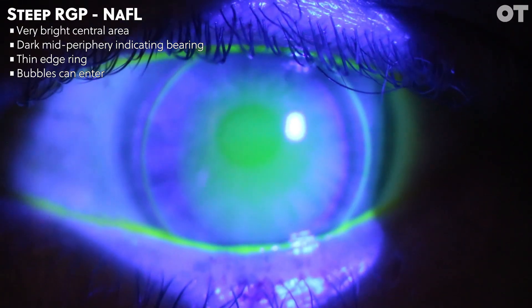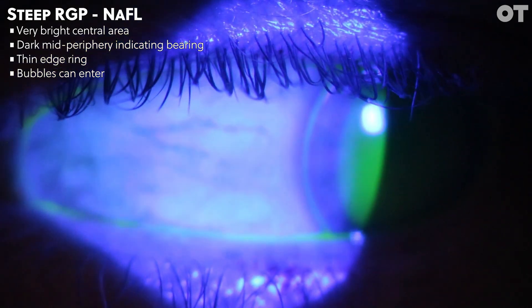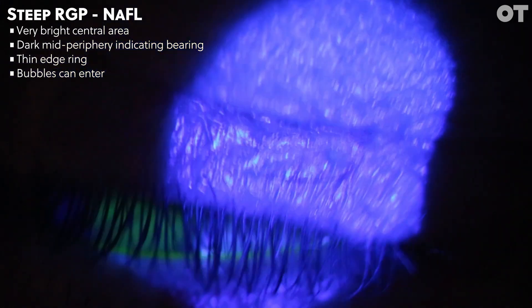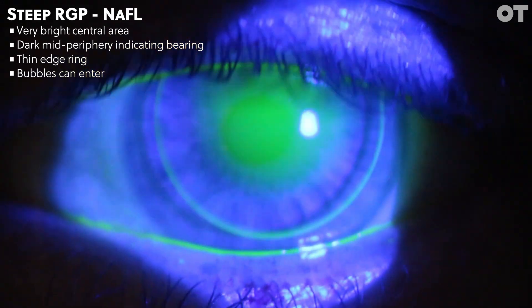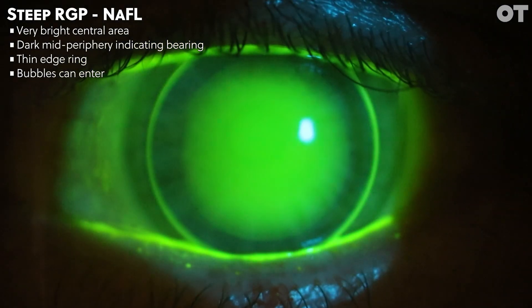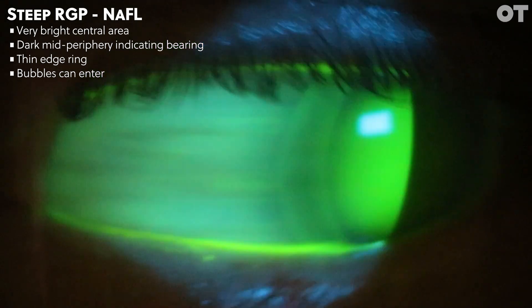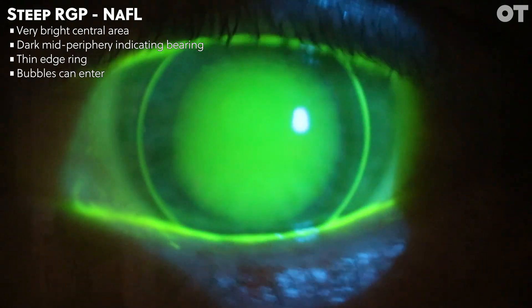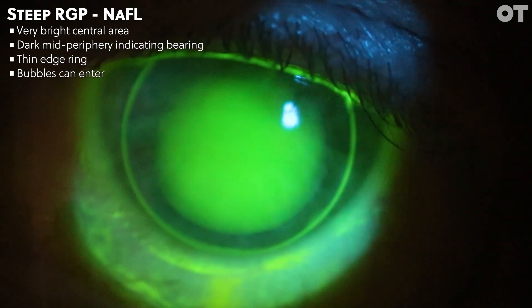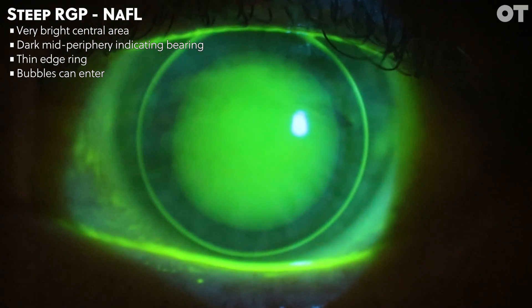The next two videos show an exaggerated steeply fitting fluorescein pattern. In the first video, we can see that the lens is centred relatively well. However, it shows a very bright area of central fluorescein pooling — the fluorescein centrally is so thick that it is obscuring the pupil margin detail. In the mid-periphery, we can see a darker area in the fluorescein pattern, indicating heavy bearing on the mid-peripheral cornea. The fluorescein ring around the edge is very thin, indicating a low edge clearance, typical of a steeply fitted contact lens.